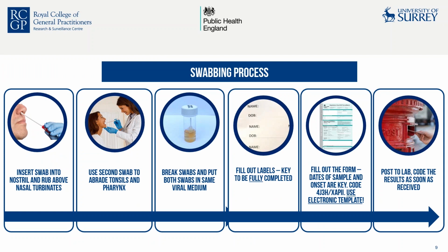I will just briefly cover how to swab. Now, please, every time a patient comes into your practice with acute symptoms of influenza-like illness or acute respiratory tract infection, please take a nasal swab and a swab from the throat or pharynx. You only need to verbally consent the patient. Please break both of the swabs. The swabs have a breaking point on them, and put them into the same viral transport medium bottle. I do realize this picture shows only one swab, however, both swabs need to go into the same bottle.